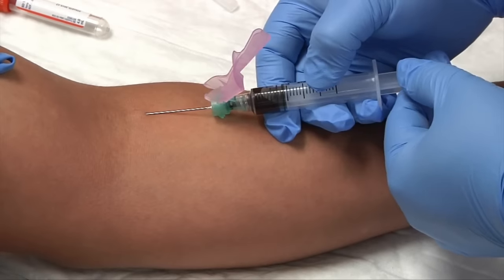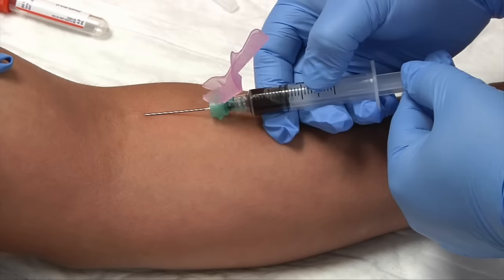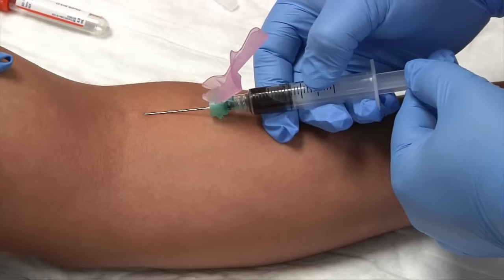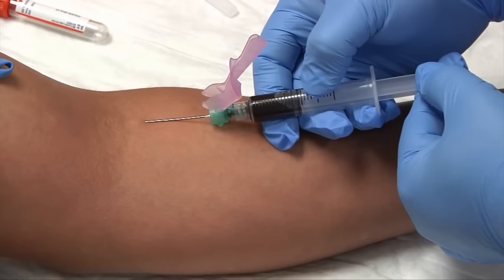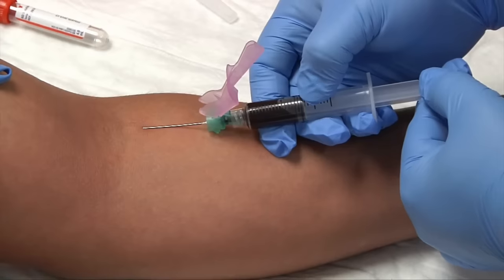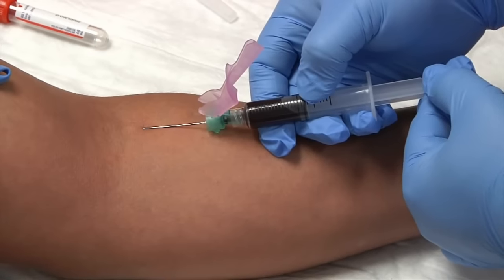Keep in mind that if we pull the plunger back too fast, we can hemolyze our specimen. Also, keep in mind your patient may be nervous — it's okay to talk to your patient; it will probably put them at ease. This could take a couple of minutes to draw the amount of blood you need.